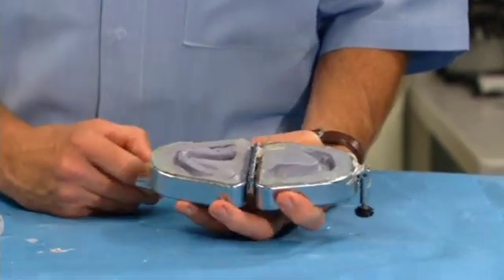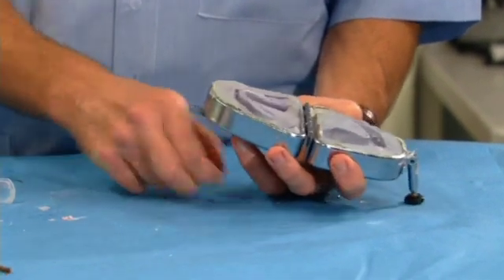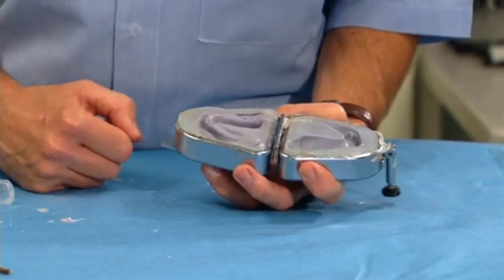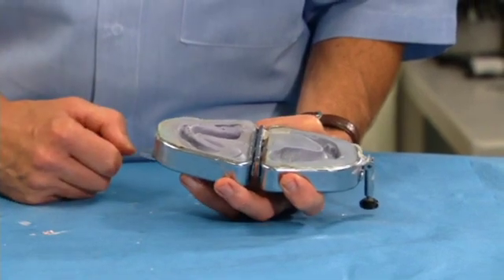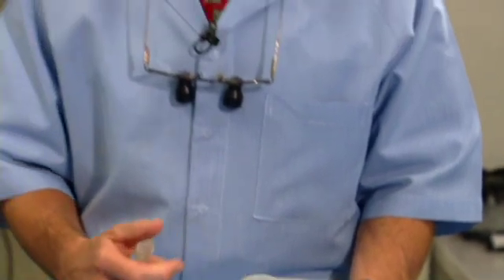As we went through the process of making her a denture, she really did not like wearing a denture. The alternative was to have some implants placed and make an implant-supported prosthesis instead of a tissue-supported prosthesis. She asked me, could we do it? Well, I had her duplicate denture, and I had an approved provisional denture, and we were finalizing. So what I did was I made a clear duplicate of her approved provisional denture.